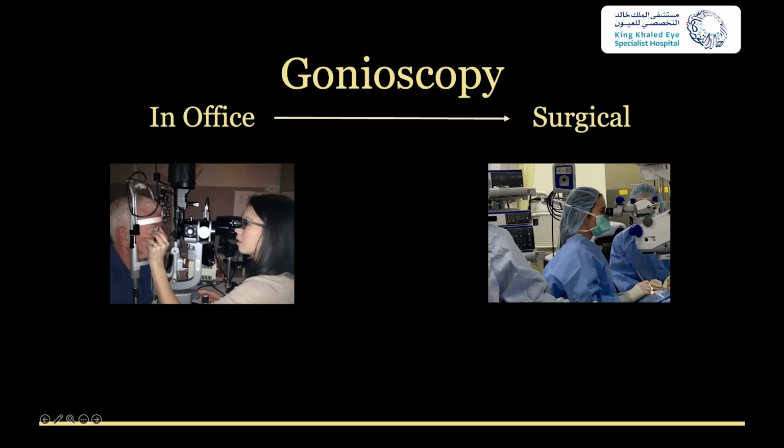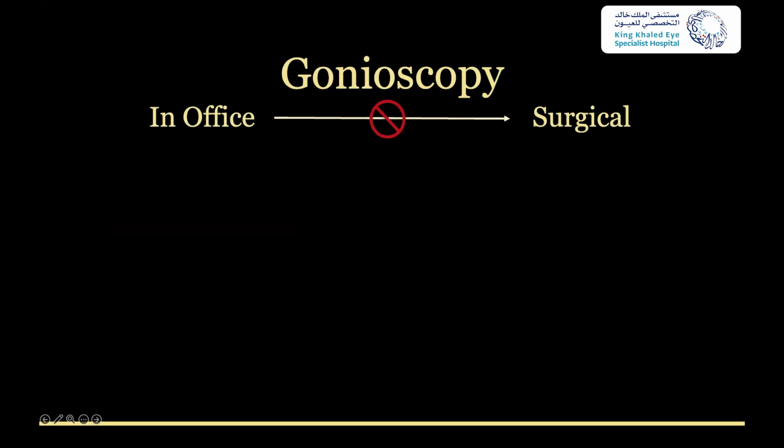And this has become a lot more applicable now because we have so many angle-based MIGS out there. It used to be that really only pediatric glaucoma specialists were using gonioscopy in the OR, and that's no longer the case. So, when I started doing gonioscopy in the OR, I think there's this idea that if you get really comfortable with in-office gonioscopy, you can translate all these tools over to surgical gonioscopy, and that's not always the case.